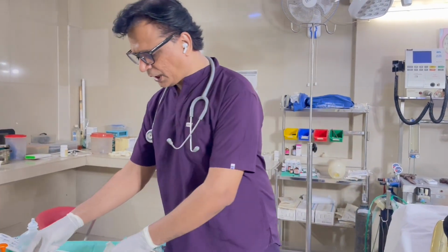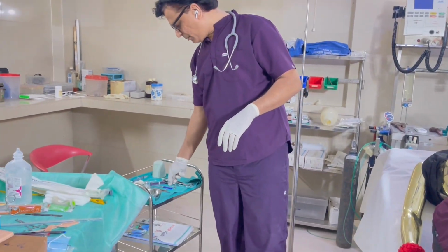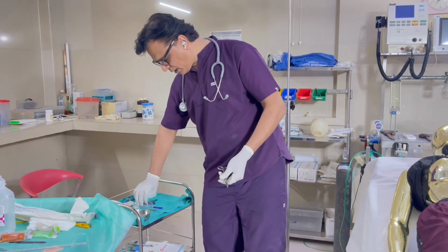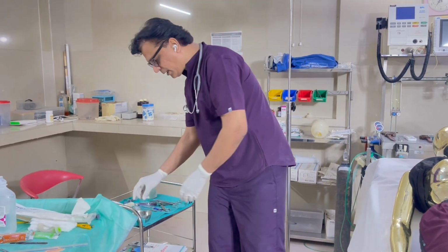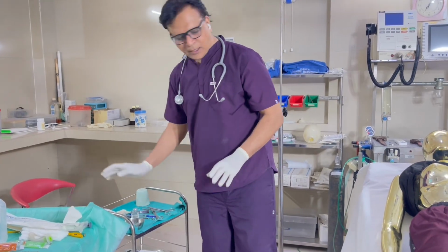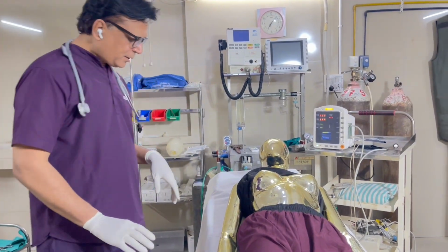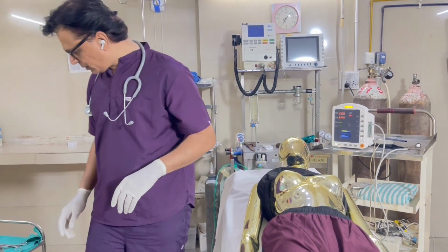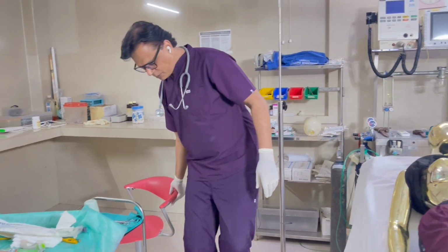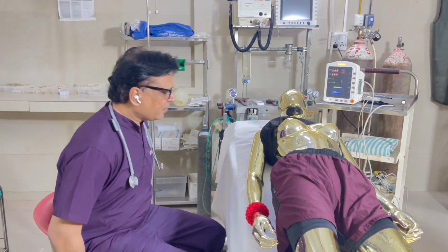So while putting it, what instruments are required? You just need a needle driver, tooth forceps, suture cutting scissors, a scalpel, then the local anesthetic numbing agent, the syringe, and suture material. If the mannequin is already painted and draped, take a position so that it will be easier. If you get a chair, you can sit at the level, so that it will be easy to put the drain.